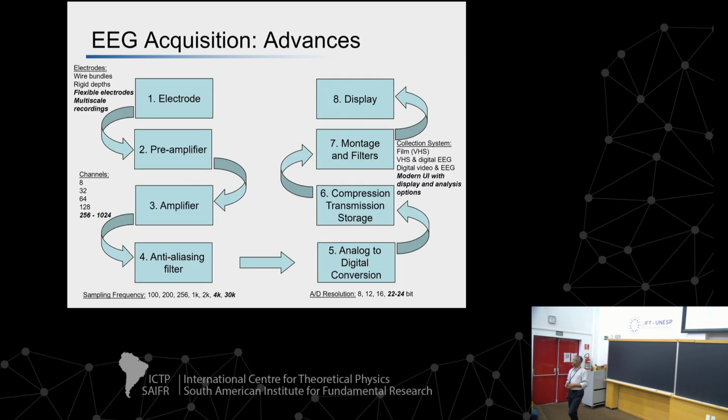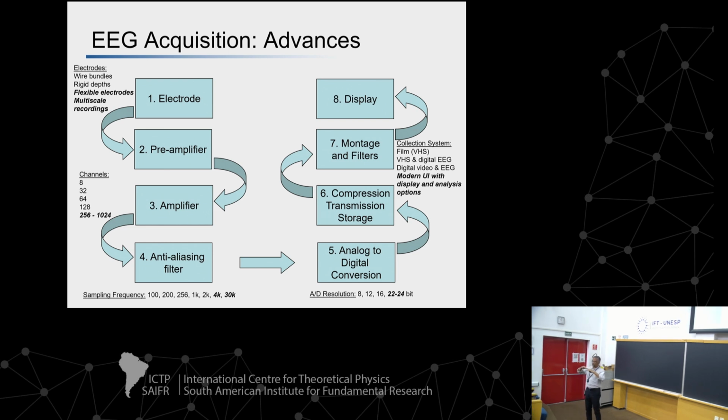Yeah. So essentially, you either sample at a lower frequency for traditional EEG analysis or at 30 kilohertz or higher for single unit activity. Single unit activity is not used in clinical decision making, but in order to capture it fully, you need to sample at higher frequencies, 30K or higher.